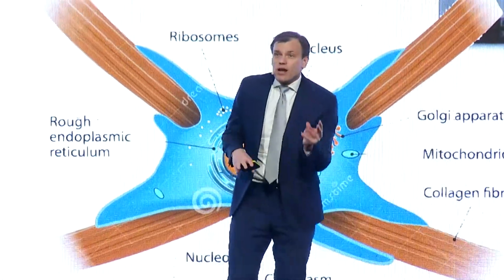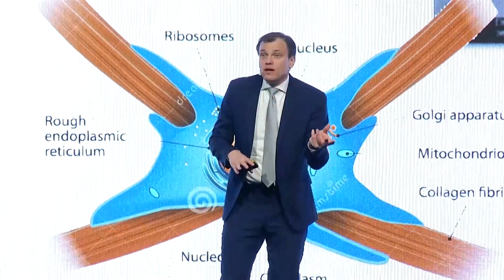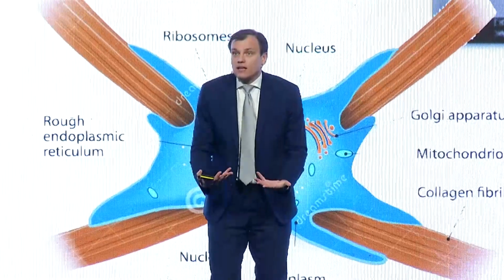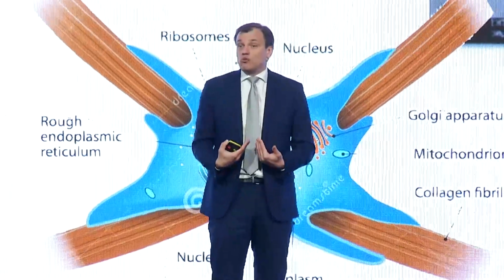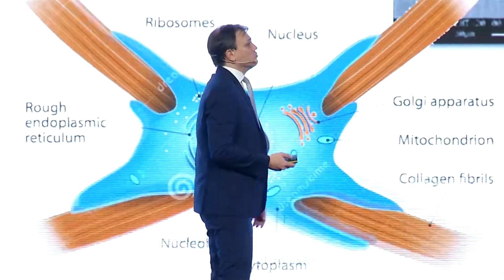What should we be thinking right away? Remember plaque zone, adherence zone? If there is a material which inherently does not attract the plaque, I take it, because that's what I want to have: a high adhesion zone, lower plaque zone.